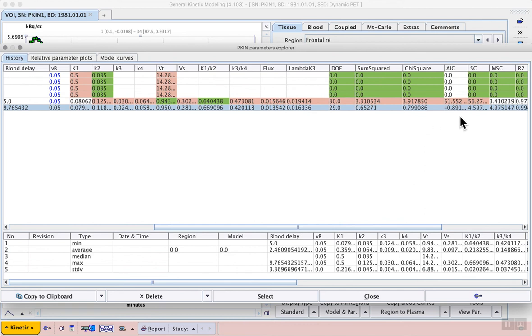In this case smaller values indicate a better model fit, so this suggests that including the delay in the model improved the overall fit.